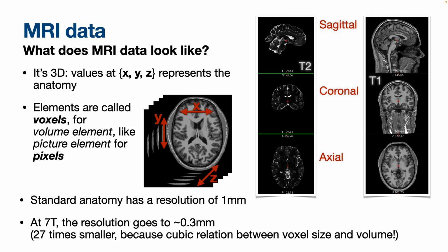This is just a nice example of how using the scanner in just a slightly different way gives different images. Each of these costs 6 minutes to acquire. This is my head again. 6 minutes to acquire each. You don't really hear much of a difference at all when you're in the scanner. It's just that the image that comes out is quite different. It's just the way that you use the scanner has changed.